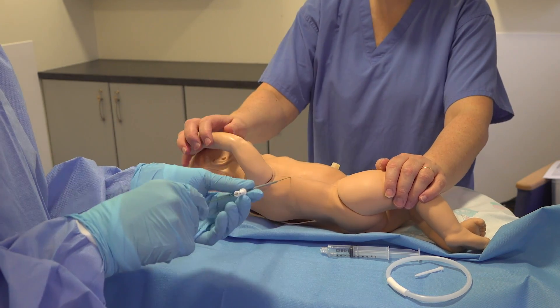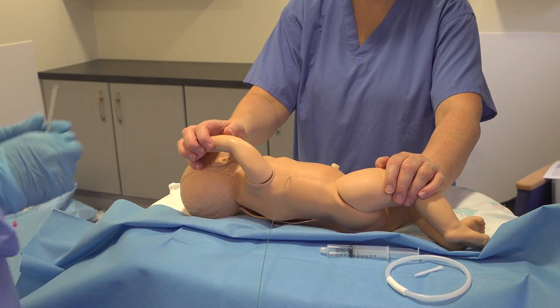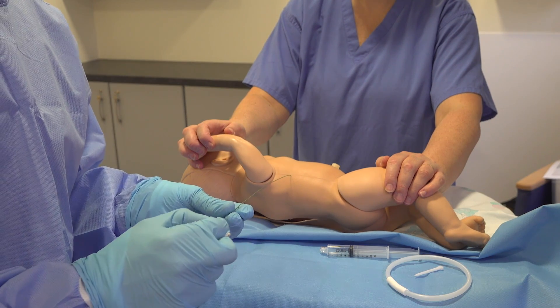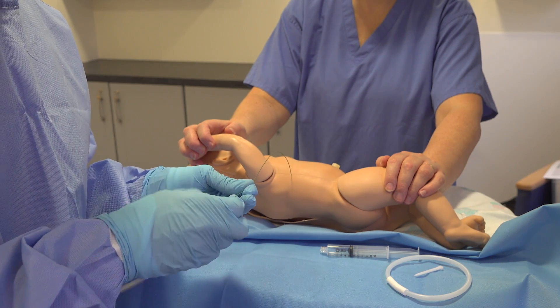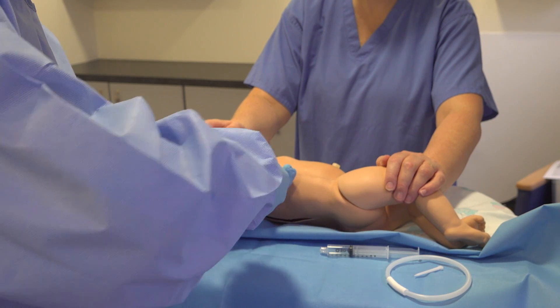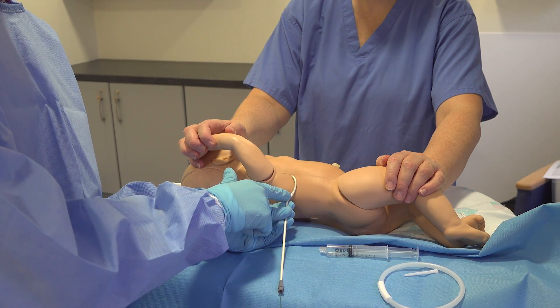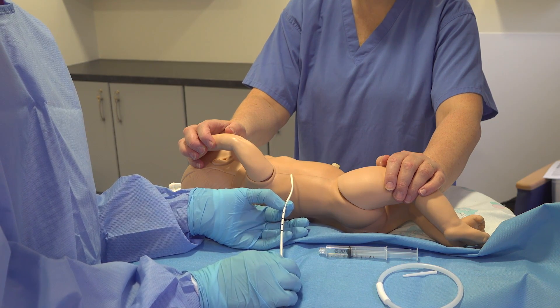Take your dilator off — you will see blood coming from the skin, so you can just get rid of that with your swab. This is the tricky bit because the pigtail catheter is curved at the end. Keep a hold of your guide wire and put your pigtail over the top. Always make sure you're holding on to your guide wire during insertion, and push the chest tube in until all the holes disappear through the skin — usually you will go to the first marker.